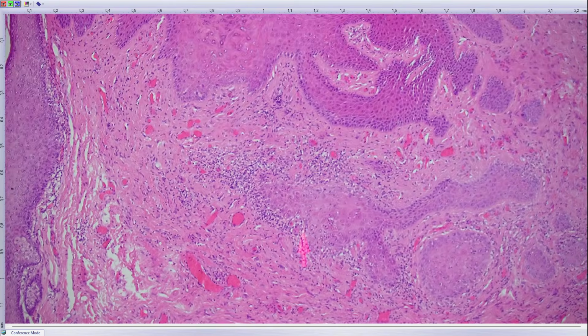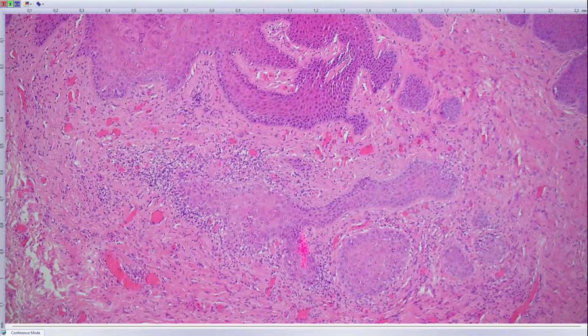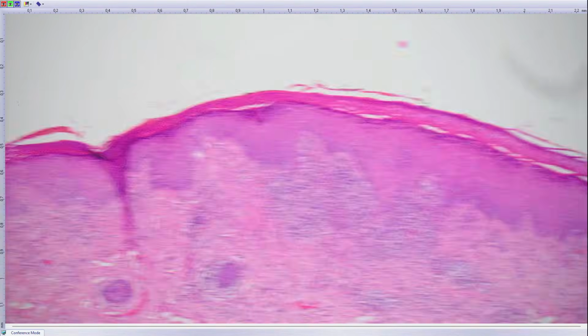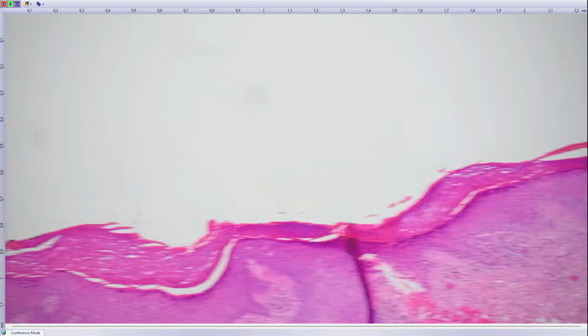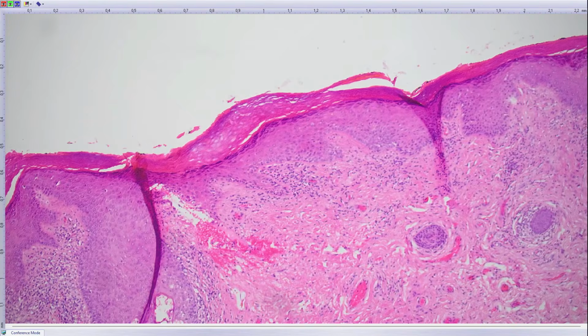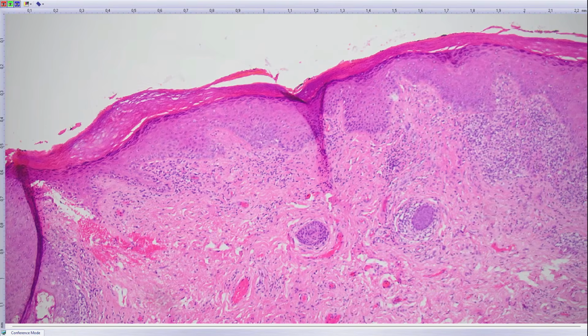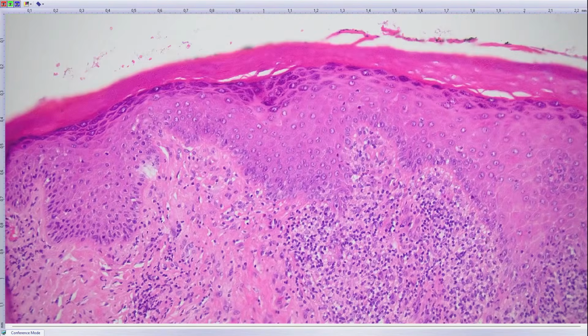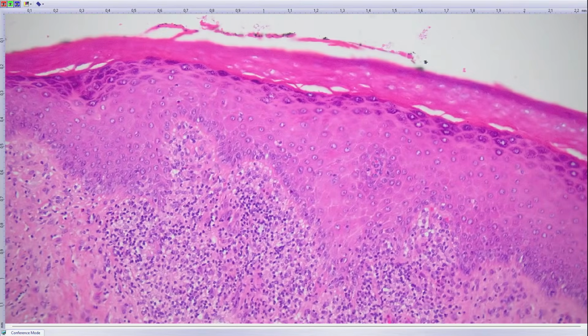And you see that somewhere there are foci that could be already classified as superficial incipient squamous cell carcinomas. Yeah, we warned the surgeon that he should take it at least 2 millimeters to the deep of the dermis, so that it was done like so. And another interesting thing here is the epidermis, which is having atypicality in basal areas.